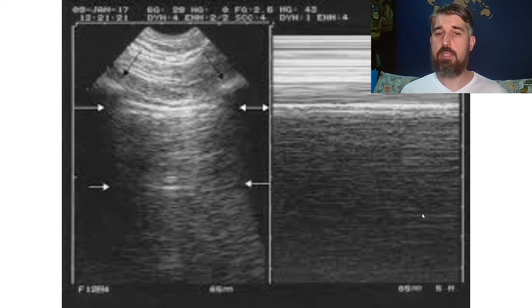Again, the radiologists in their basement were thinking about vacations and they wanted to go to a resort or something, I guess. And they saw a beach here. So if you come with me and trust me, this is the sea. This is where the waves are breaking, and here is the sand. So beaches are good places. The seashore sign is a good sign. It means a normal lung.